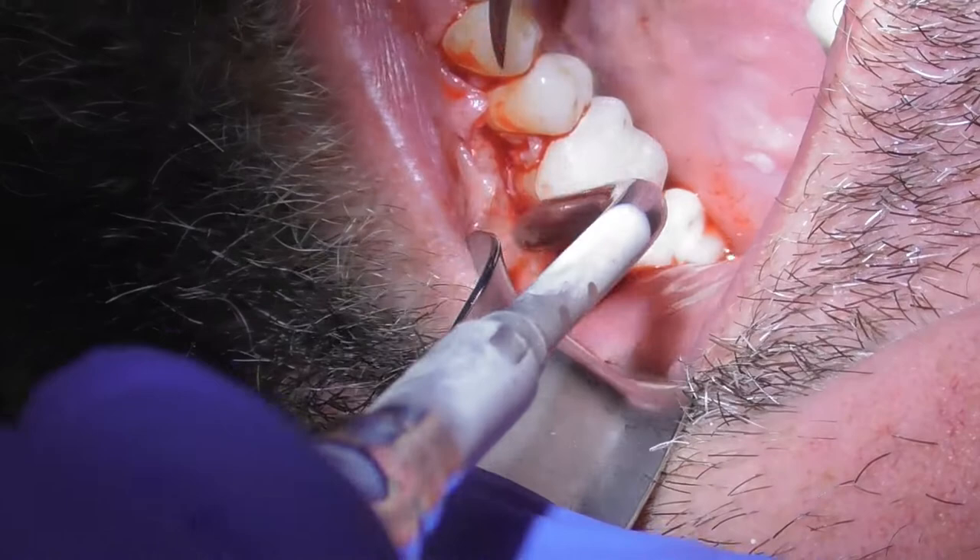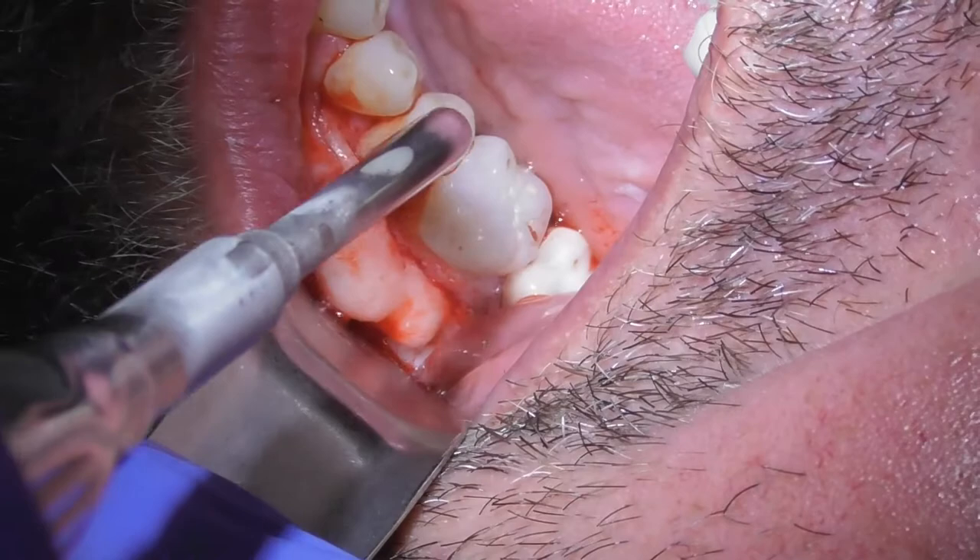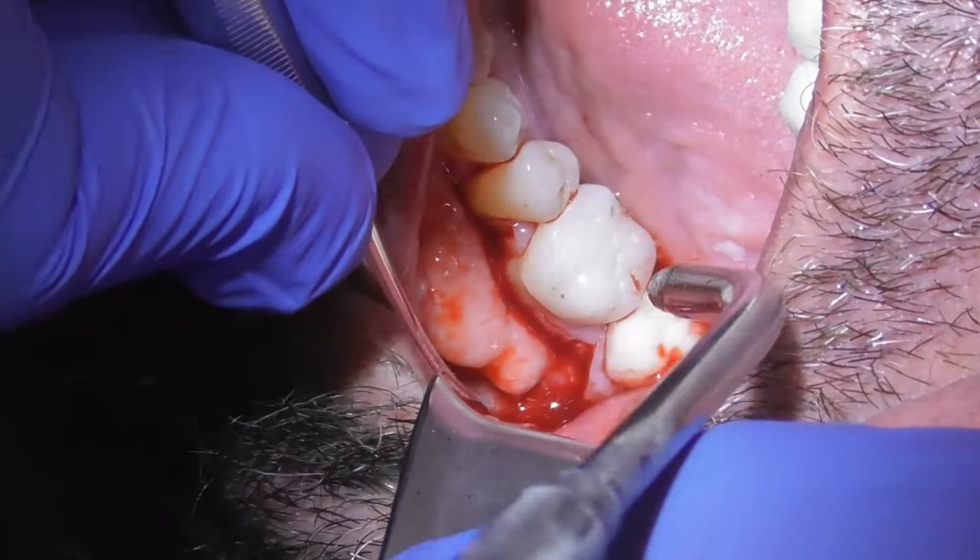Now I have this nicely visualized — I can see exactly the area we're working on. What I'm going to do now is get my little drill and just smooth that down.